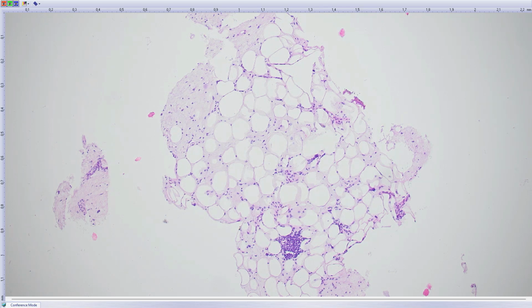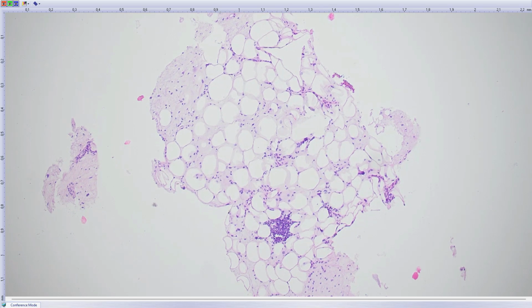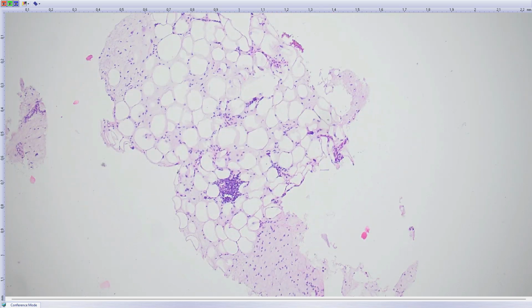Otherwise, you can do immunohistochemistry with MDM2 to confirm the MDM2 amplification here. The immunohistochemistry works usually relatively well, but it's not 100% reliable. So if I have so little tissue, I do just FISH, and MDM2 FISH was positive for amplification.